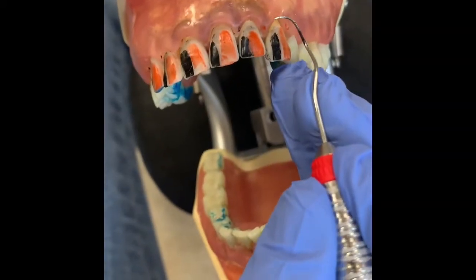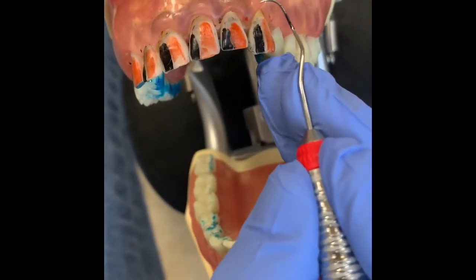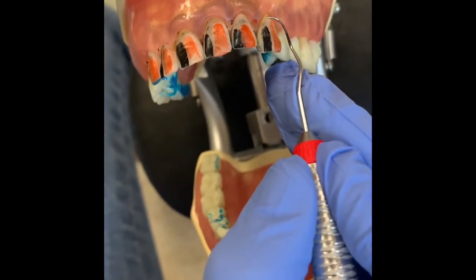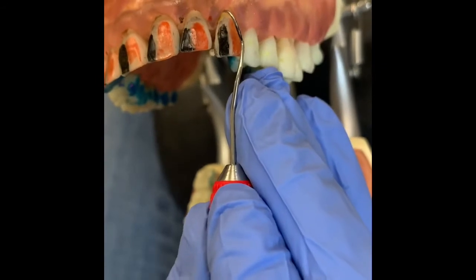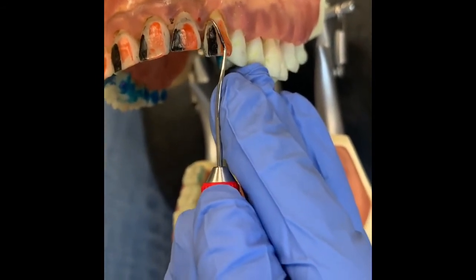All the surfaces towards us, all of them, starting from this position. So we start at the middle of the tooth, surfaces towards, and I'm starting from the tooth furthest away from me, canine furthest away. Drop below the gums and explore. Remember, your strokes are still 1 to 2 millimeters. Go into the interproximal, 51%.